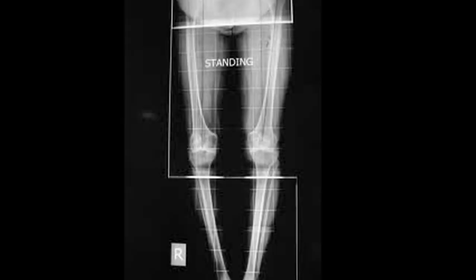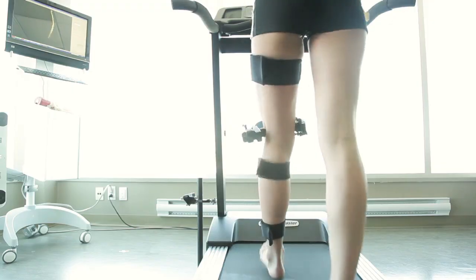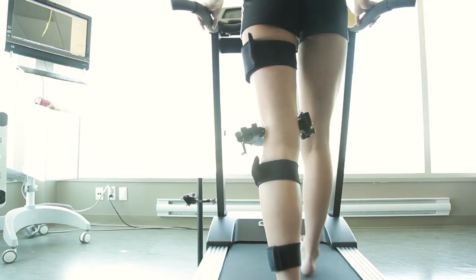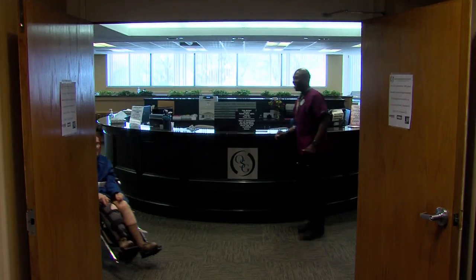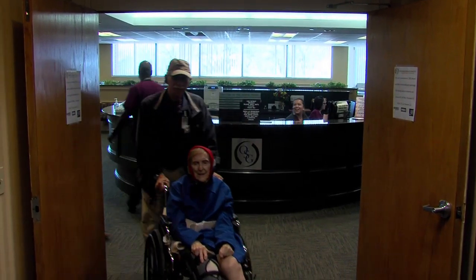Current physical assessment and clinical assessment is basically done in a static position. You're standing up in an X-ray or lying down in an MRI. What the KneeKG does, it assesses your knee while you're actually moving. So the joint is moving, it's getting pressure, and we're actually better understanding the mechanics of your joint to personalize a treatment plan. The KneeKG is easy to use, quick, economical, and performed in an outpatient or therapy office.